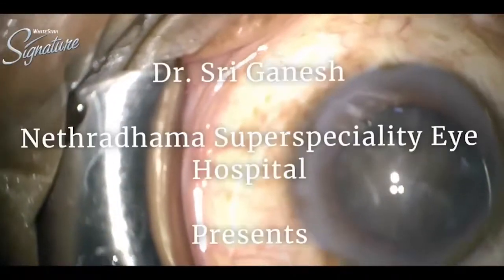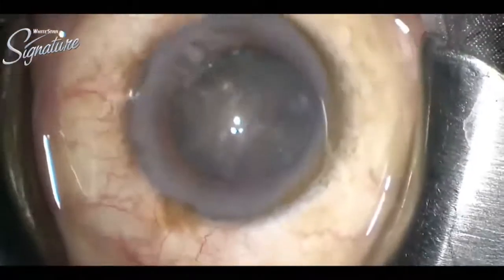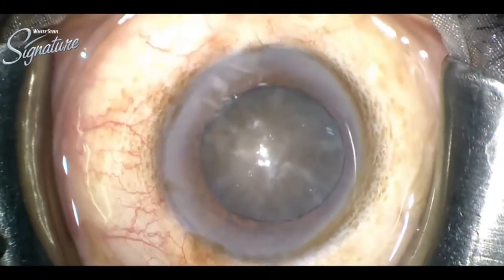Hello friends, today I am going to demonstrate direct chop done by Dr. Sri Ganesh in a hard brown cataract.